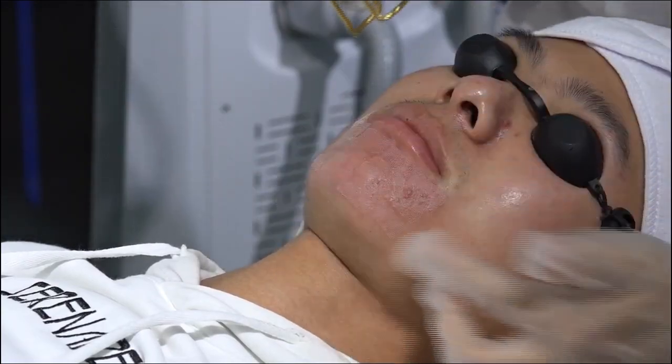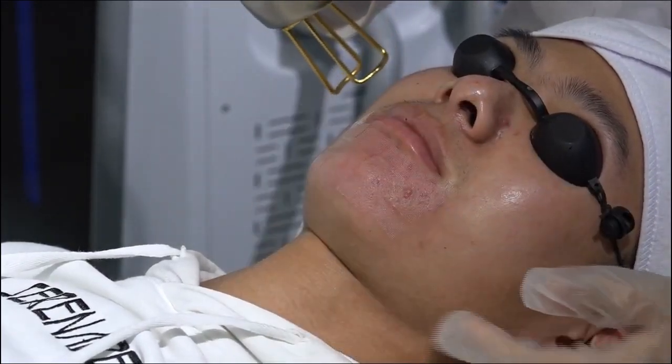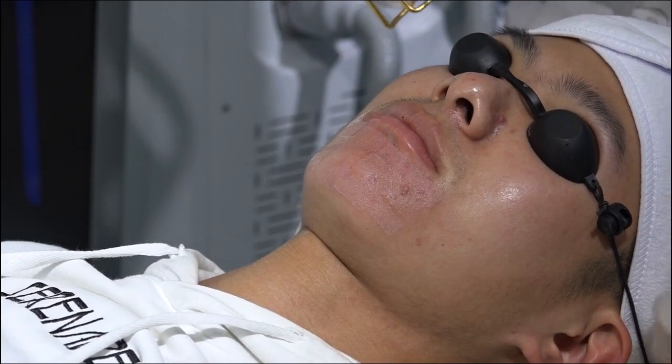Okay, now we do the face one time is okay. Do the acne scar here. And now we will do the nose here.